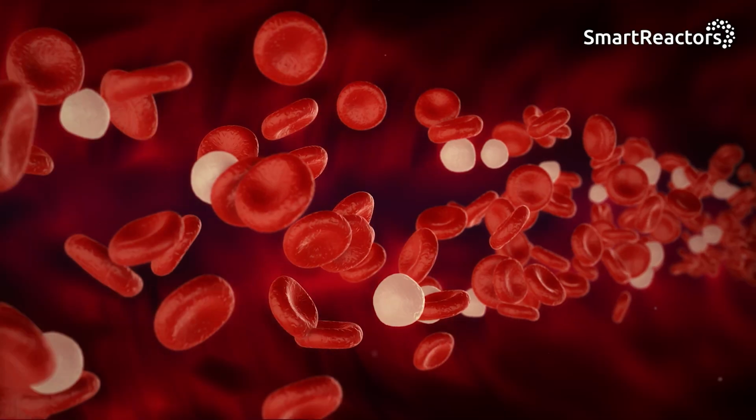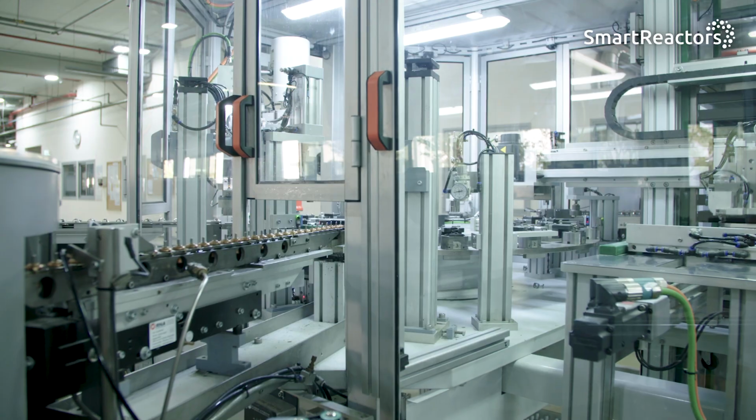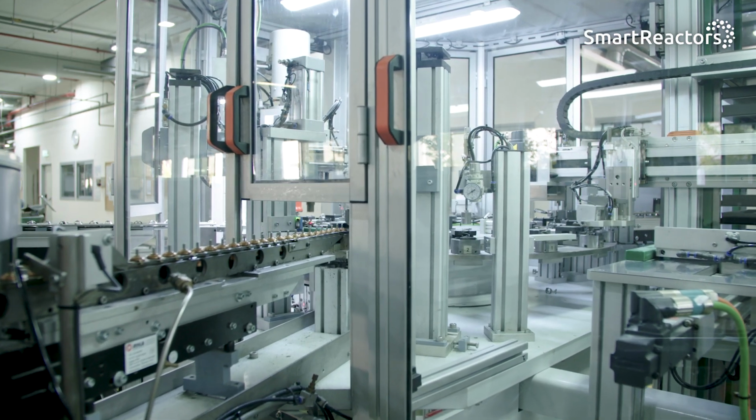You also have to consider durability, so the degree of cross-linking and how the coating will hold up to the expected shear flow in blood, or the mechanical stresses during manufacturing, or the deployment forces that it's going to see while being implanted into the body. So we have to look at mechanical forces, and we have to ensure that the coating is robust to those. We also look at the performance of the coating on a specific device, and we'll do that during hemocompatibility studies and endothelialization studies during benchtop testing.